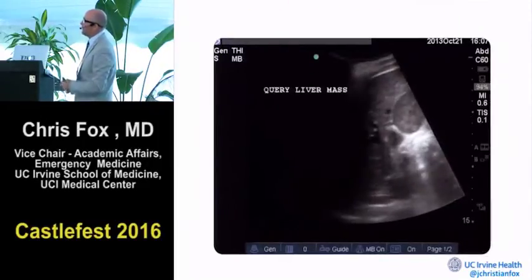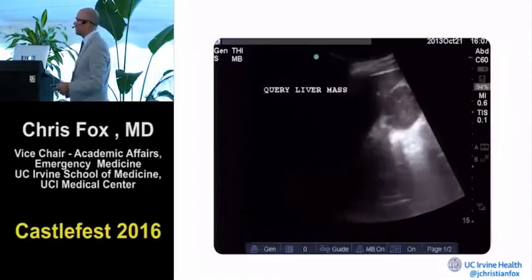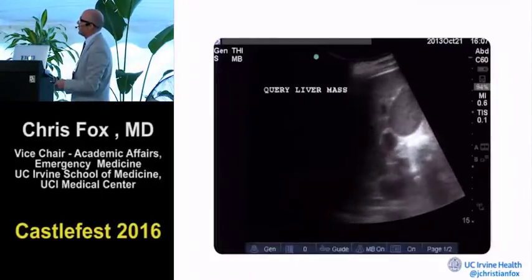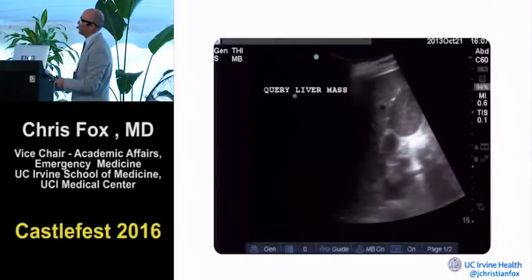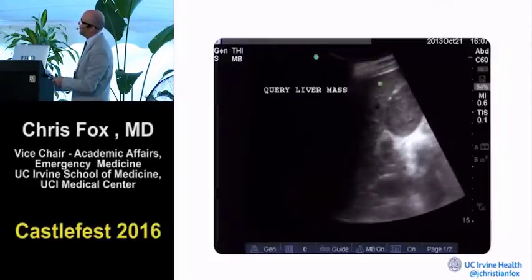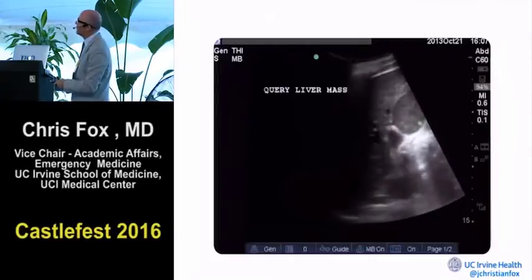In fact, I had a Dr. Shane Arishinkoff from Vancouver, University of British Columbia, come out. He's an intern, so he spent a year with me. We had a wonderful year together. Right in the beginning of his year, he used the word query. I didn't really know what he meant by that term, query. That means question, is this a liver mass? That's like a Canadian thing. And so I'm looking here, and I'm like, yeah, this looks like a mass here in the liver. What the heck is that, Shane?